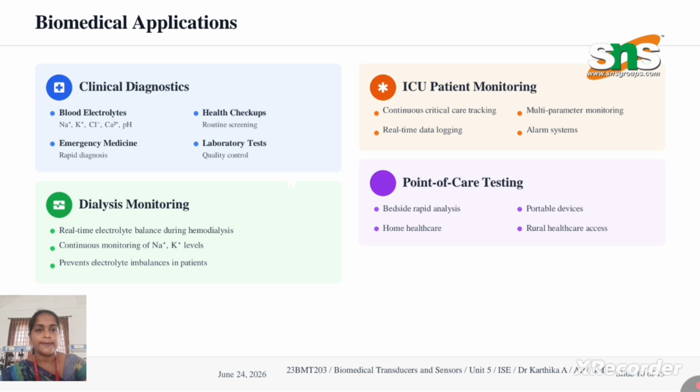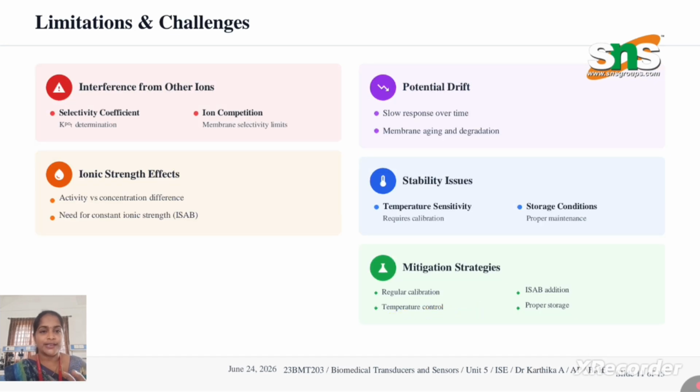Biomedical applications: we have clinical diagnostics, ICU patient monitoring, dialysis monitoring and point of care testing. We have some limitations. I have listed the limitations and challenges here.